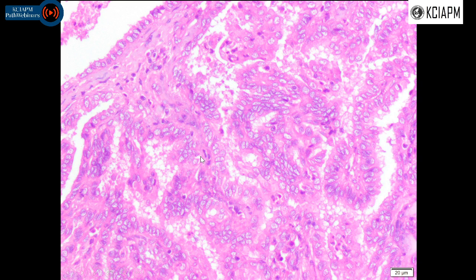It has a fibrovascular core, the surface of which is lined by cells which have elongated to oval nuclei which are clear, and many have nuclear grooves in them, and minimal pleomorphism apart from piling up, crowding, an eggs-in-a-basket appearance.